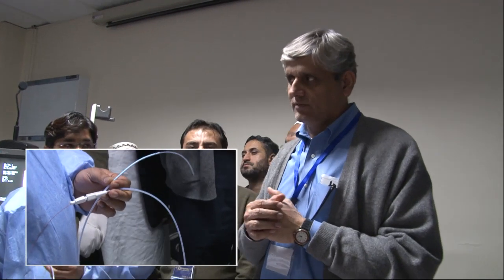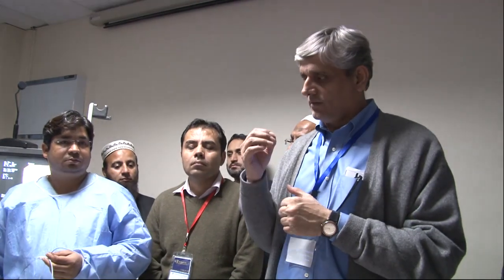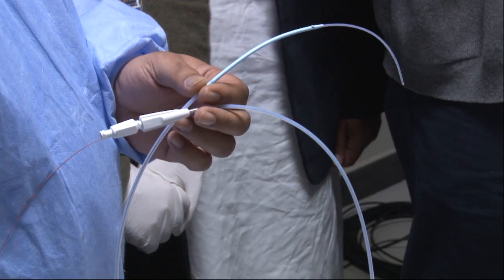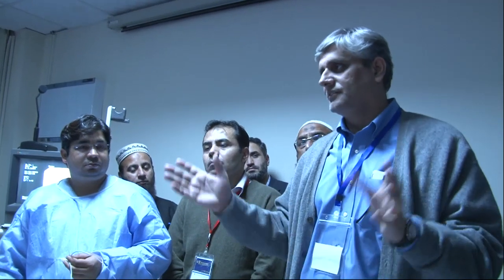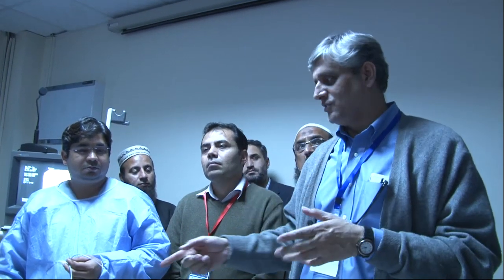I have been stuck, and it's a nightmare. You can't do it by yourself. Remember, I may be the best ERCPist there is. You give me somebody who doesn't understand how to push and advance and pull and all that stuff, and he does something wrong, I'm done.